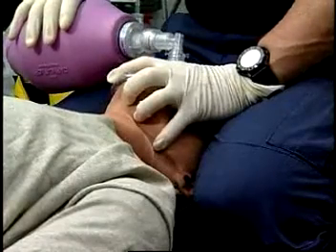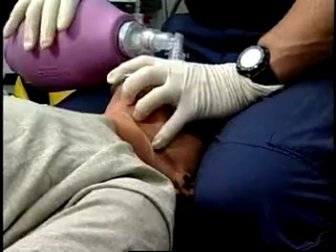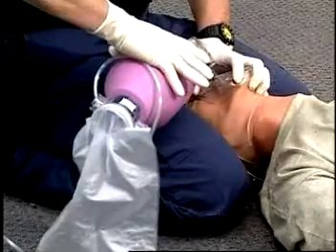Hook your little finger, or ring finger and little finger, under the lower mandible to keep the mandible elevated and to avoid any loss of the seal with movement of the chin.